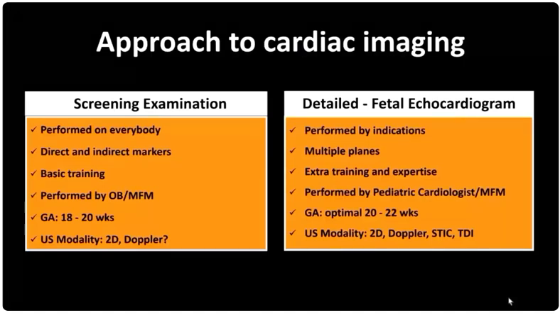Usually this exam is performed within the settings of general OB, even though some MFM practices do this as well. We usually target a gestational age between 18 and 20 weeks. This is the typical gestational age for our second trimester screening exam, not just the heart, but the entire anatomy evaluation. And we rely on the 2D mode in terms of the ultrasound modalities used. I will show you that some guidelines suggest the help of Doppler is really important for screening.